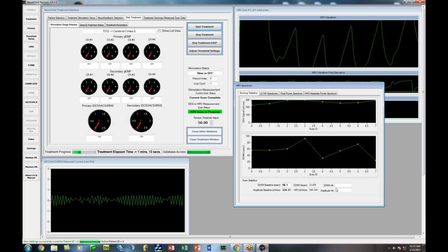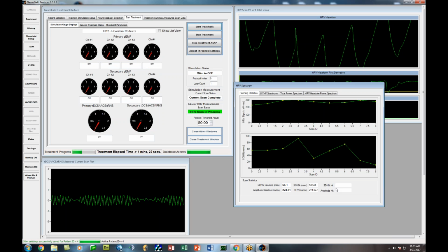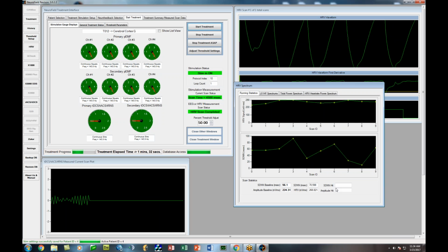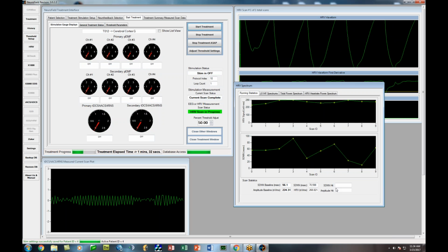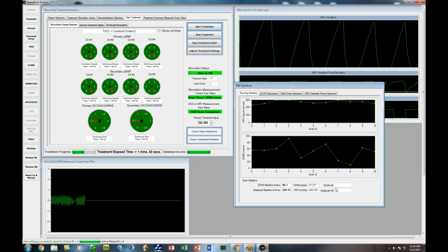Now it's going to jump through basically 21 different frequencies. And you can do this procedure with coils. You can do it with the ACS. There's a lot of different ways to administer it. And we typically do it with the coils. Although you can use the ACS to treat pain.